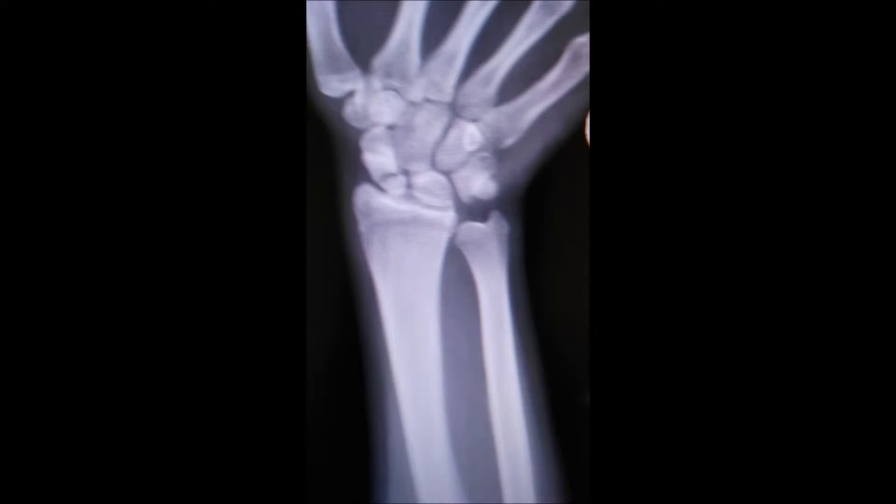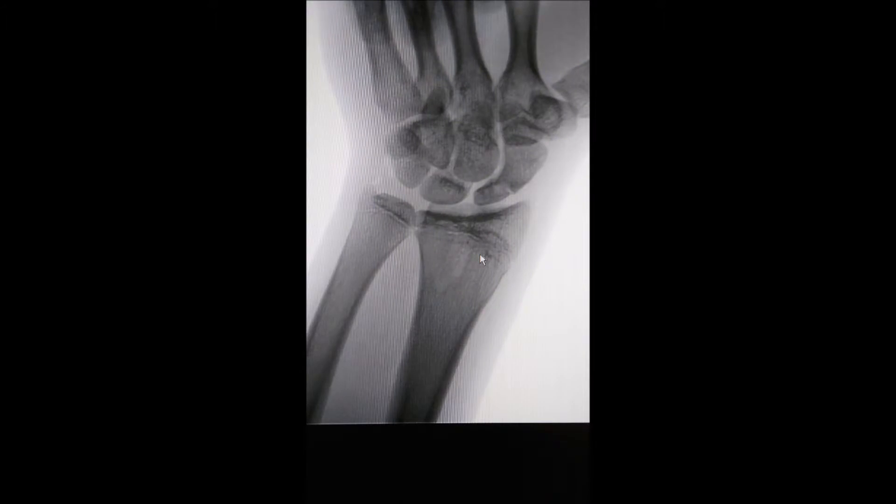Initially in these non-unions, you have to make a small incision, about maybe an inch or so. We have to prepare the fracture ends up to bleeding bone, so that when we put in bone graft — that is, small pieces of bone from elsewhere in the body.